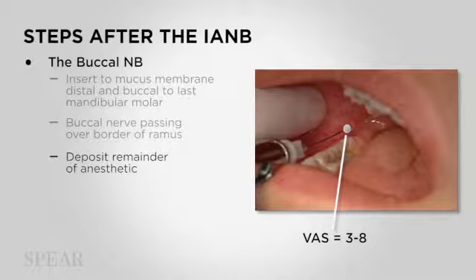And the problem with this injection is the moment your needle enters into the soft tissue, you're on periosteum, and periosteum is very sensitive. You can put topical on to make the needle puncture painless, but there's really no magic answer to making this injection painless, because if you start injecting local anesthetic as soon as you enter the soft tissue, it leaks back out into the patient's mouth.